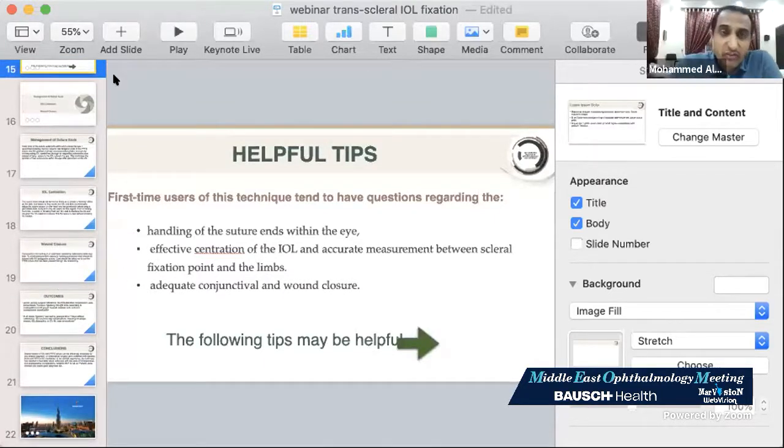Thanks a lot for this very excellent presentation. Let me tell you, Safwan, showing the sclerotomy, you show a wonderful technique using the Gore-Tex, wonderful. If you have the lens in, use the lens in, because it's by far more simple. That's why, Carlos, I didn't show the lens in.